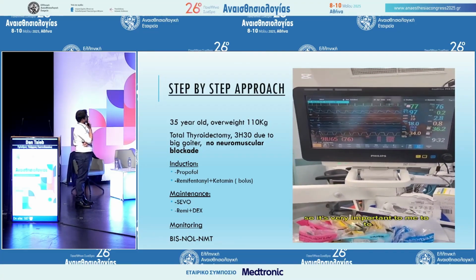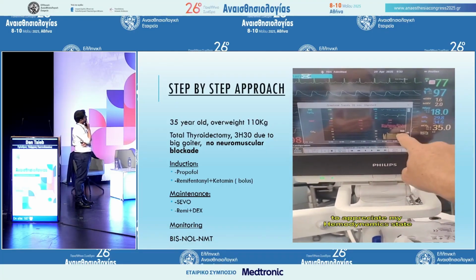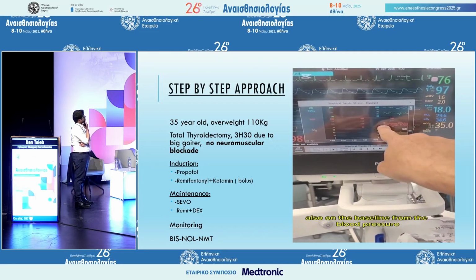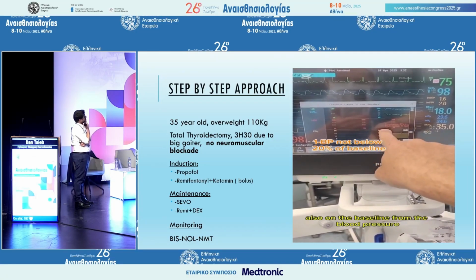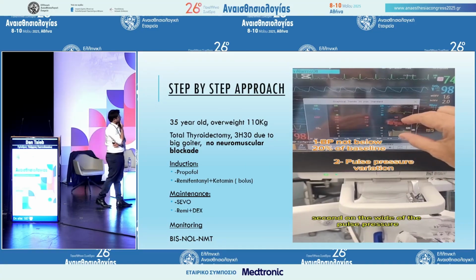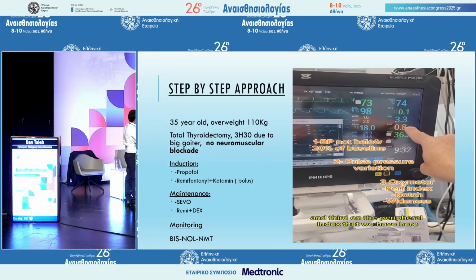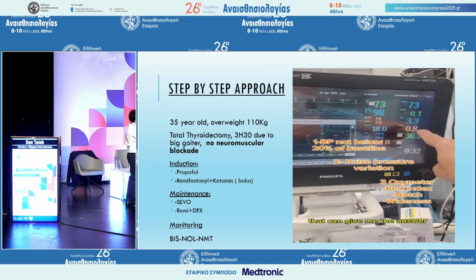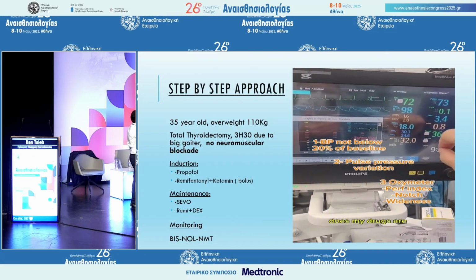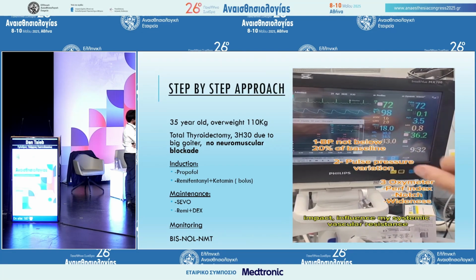And so it's very important to me to appreciate my hemodynamic state, first on the baseline of the blood pressure, second on the width of the pulse pressure, and third on the perfusion index that we have here, that can give me the answer: do my drugs impact, influence my systemic vascular resistance?